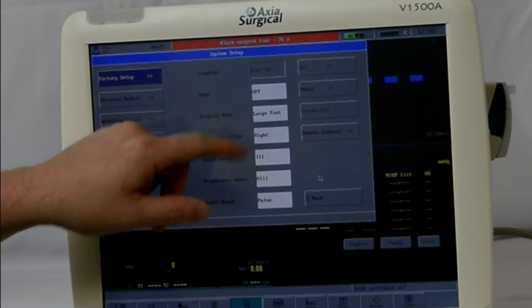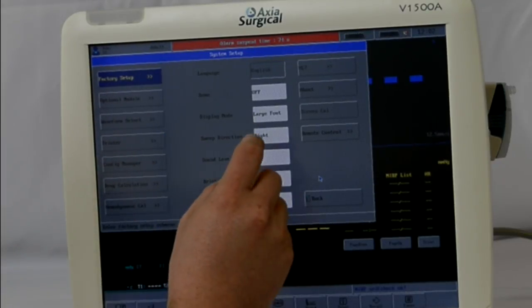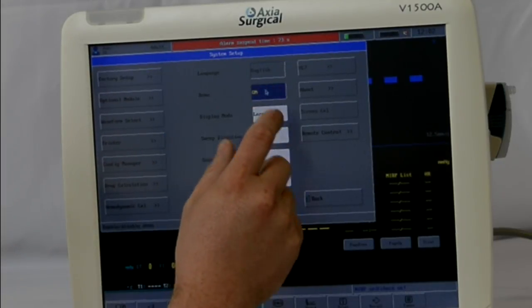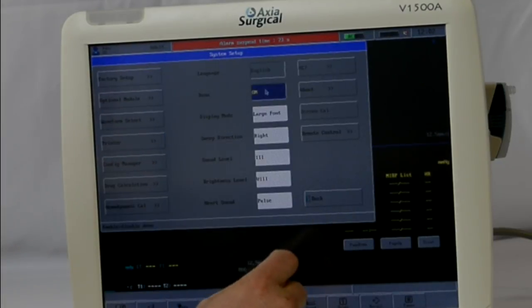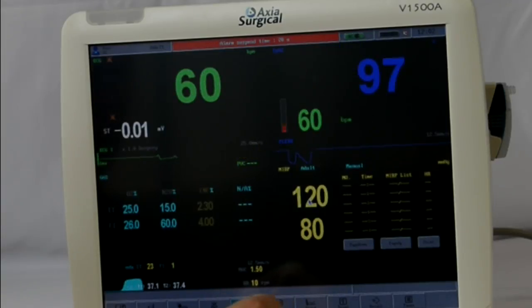Now you can see it is no longer grayed out. To turn demo mode on, tap it once, and you are now in demo mode.